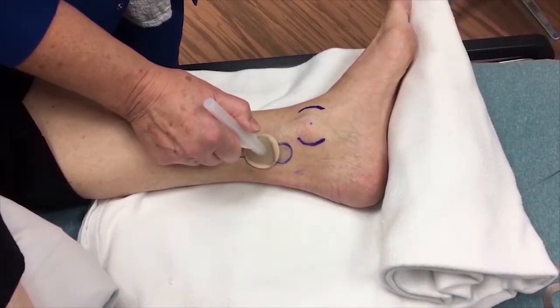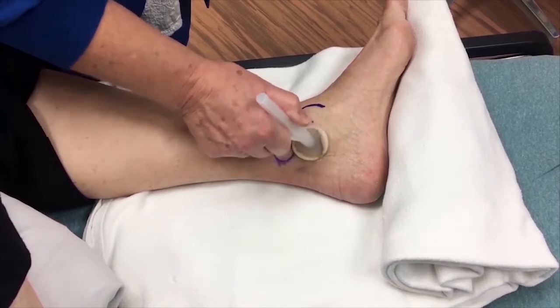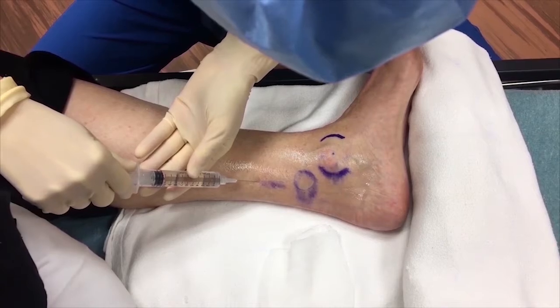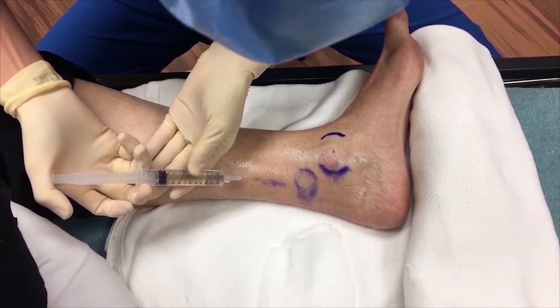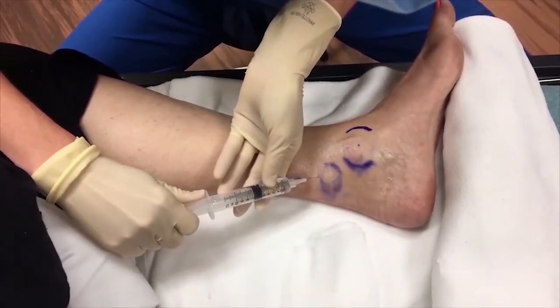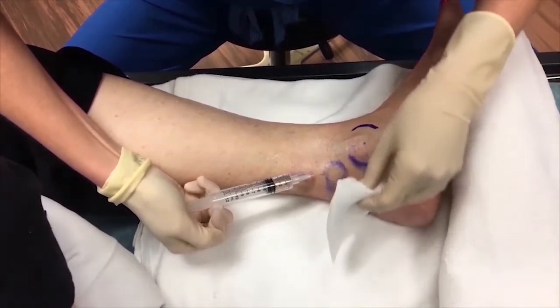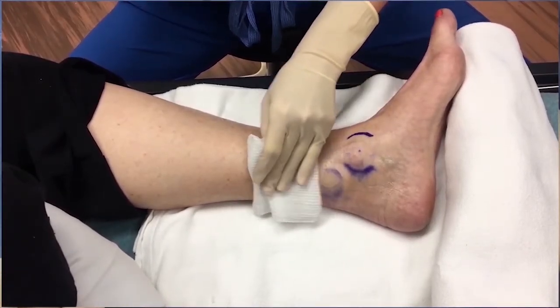Step 3: Inject Local Anesthetic. Clean the skin around and over the anticipated injection sites with isopropyl alcohol swabs, taking care not to wipe away the markings. Using a 25 or 27 gauge needle, generously infiltrate local anesthetic subcutaneously into the leg — typically 10 to 20 milliliters is needed. A long-acting local anesthetic such as bupivacaine with epinephrine is recommended. The treated area should generously include the planned incision, the planned device location, and areas in between. After injection, massage the area to promote diffusion of the anesthetic into the surrounding tissues.